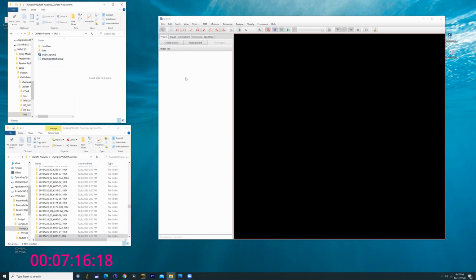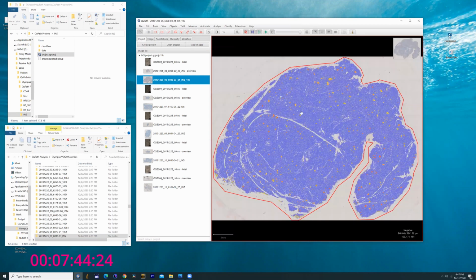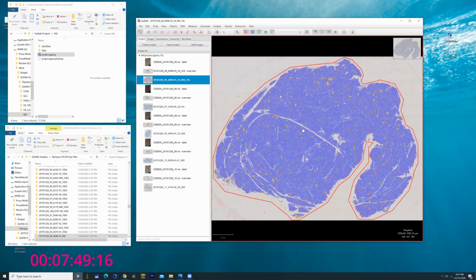So if you drag this into here, this will open up and generate a list of all the files, the links, and within each of these, you actually have the raw data. Here, one second, I'll click on one and show you what I'm talking about. The raw data along with the image. It takes a minute. So this is the actual slide from above with the new overlays.